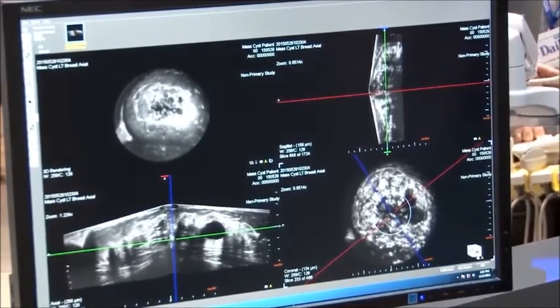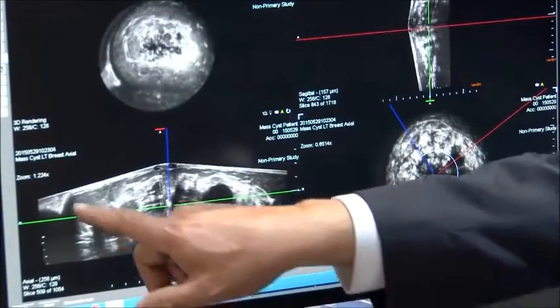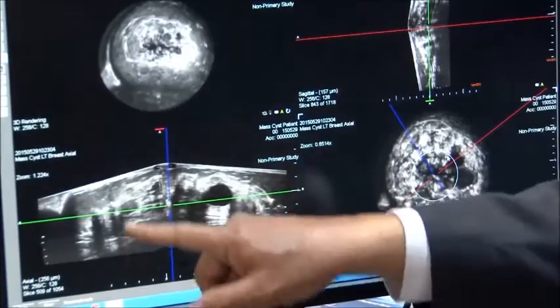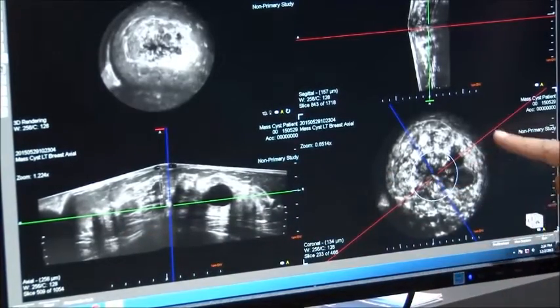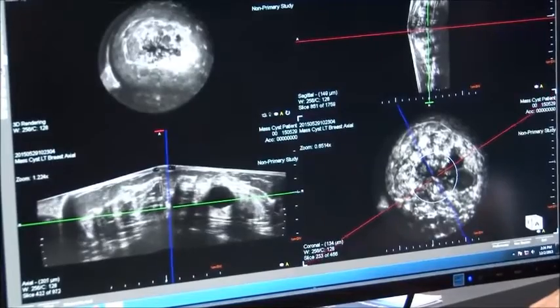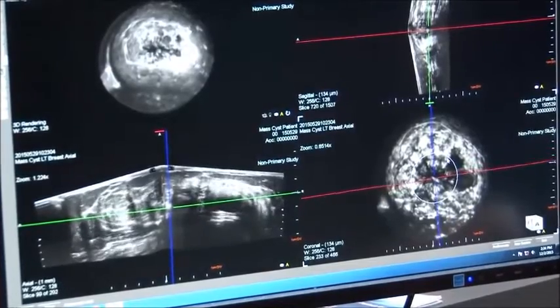So here we see some benign cystic features with posterior enhancement. And as you can see, I want to point out that in all of these images, you see the skin line here, you see the arc of the pectoralis here. That ensures that you're getting all the tissue in your field of view as you're reviewing. And this coronal view gives you the positional data. So now, I'm going to continue to rotate through the case. And so everything that we've looked at in this case so far has been benign. And we see another large cyst coming up here.